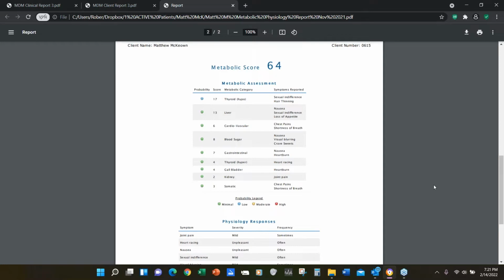So what I say is, I get this information. I'm not going to tell you that I'm the expert in interpreting it, but it's telling me that we need to find out more. And so I don't take responsibility for saying that. And maybe tonight somebody can give me an easy way to explain how you can show hypo and hyperthyroid in the same assessment and what to do with that for people. I have found a way around it so I don't get trapped, but if anybody has how they handle it when you see both.